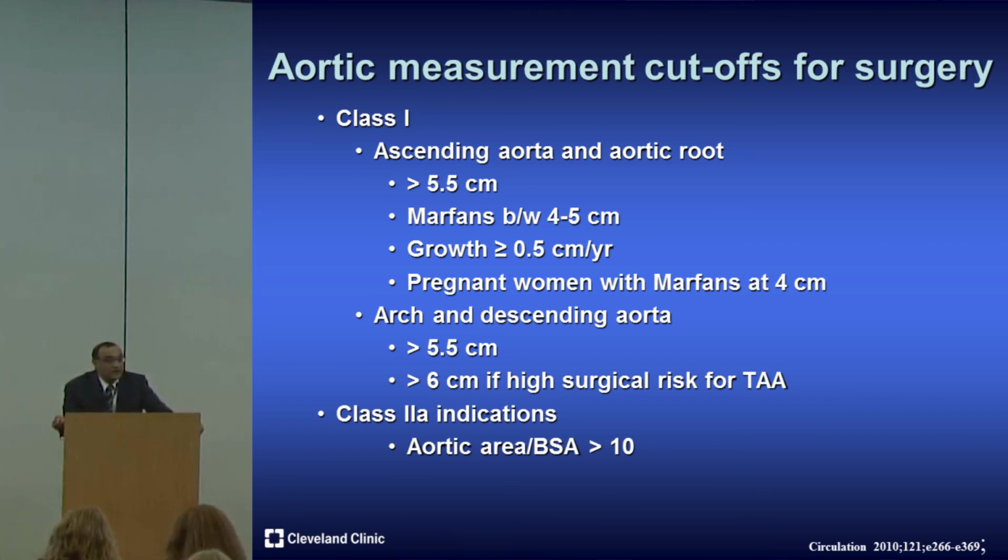Certainly, if the aorta is growing at 5 millimeters or higher rate per year, it is important to trigger an operation. But it is more important to be confident about the change. We have to measure the dimensions ourselves to convince ourselves that there is indeed growth, okay?